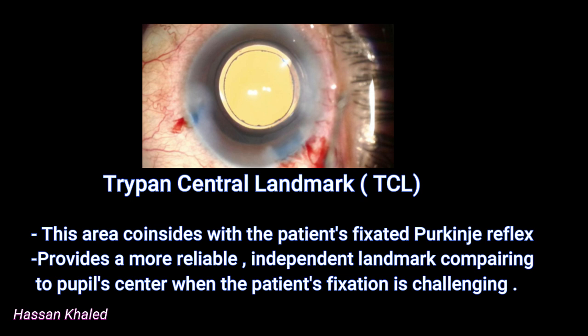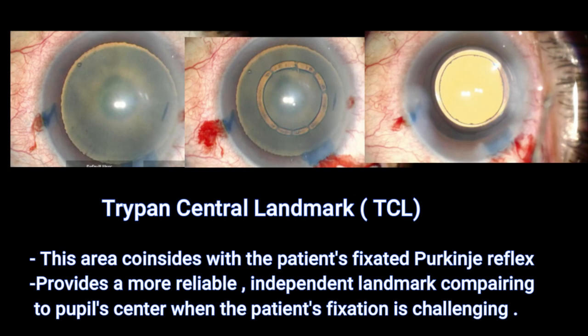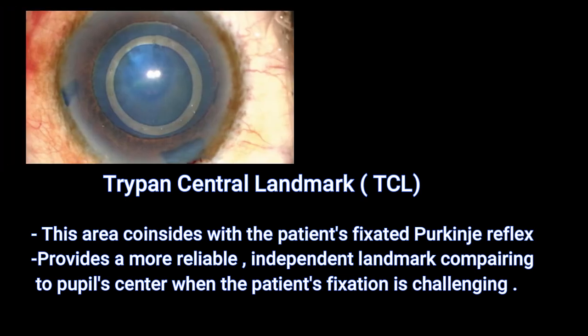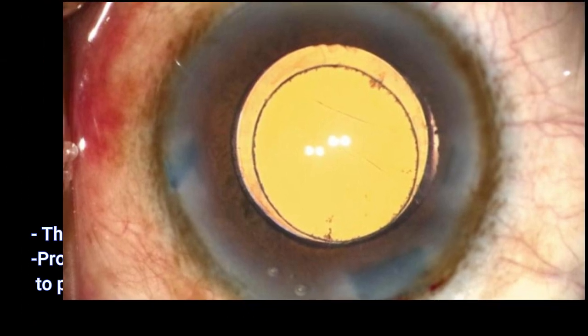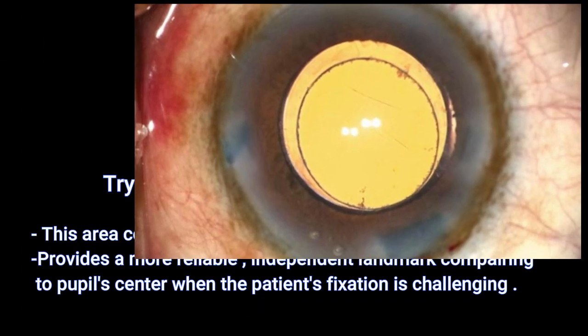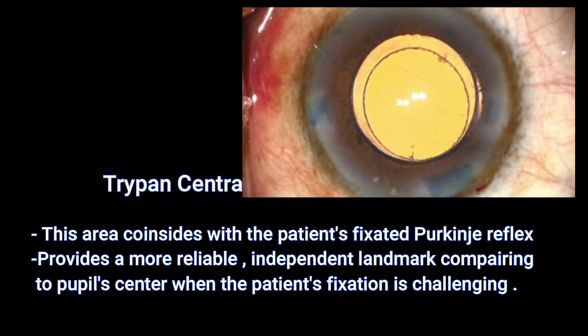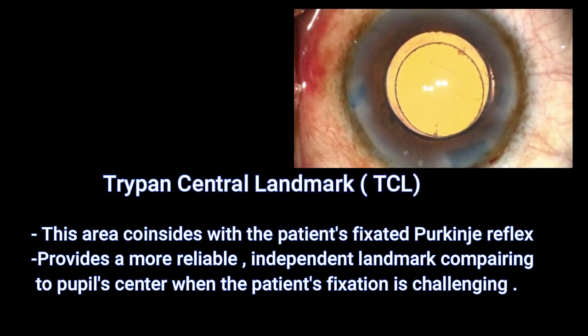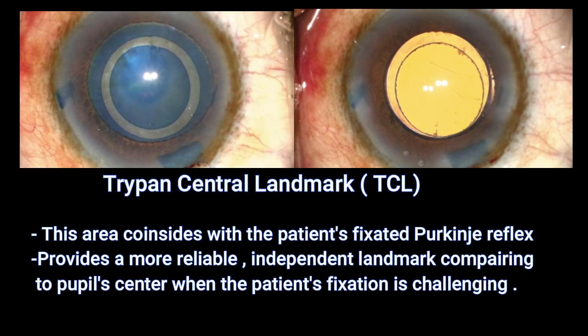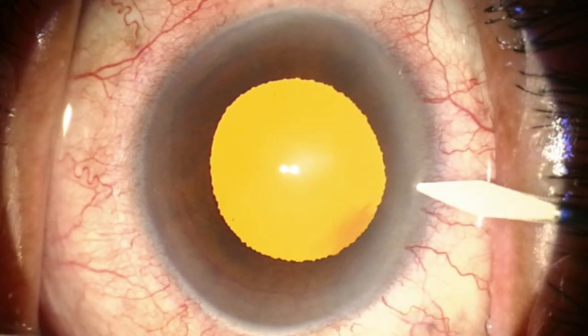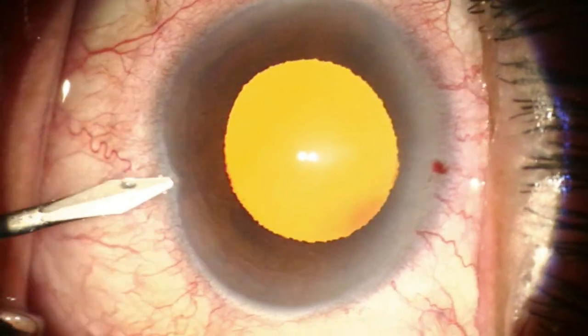However, in this picture, we can see that the capsulorrhexis is eccentric with the trypan central landmark. Look at the result: we can see it is also eccentric with the optic of the IOL. The overlapping is good in the superior part; however, it's not good in the inferior part of the IOL.